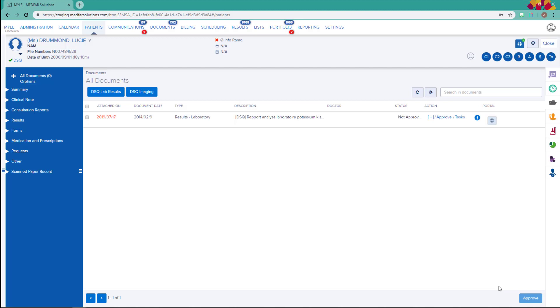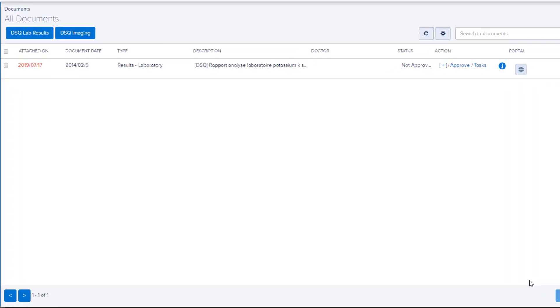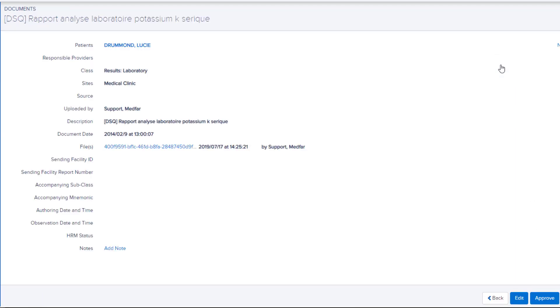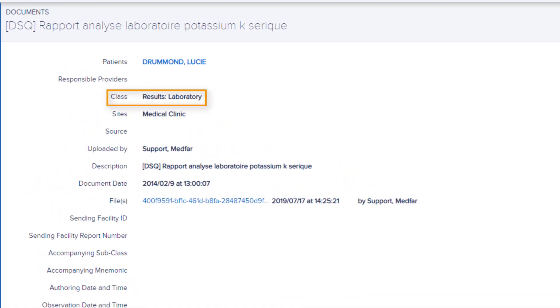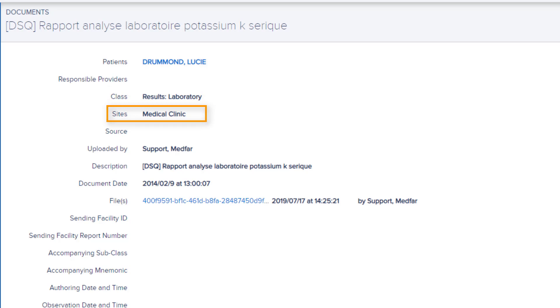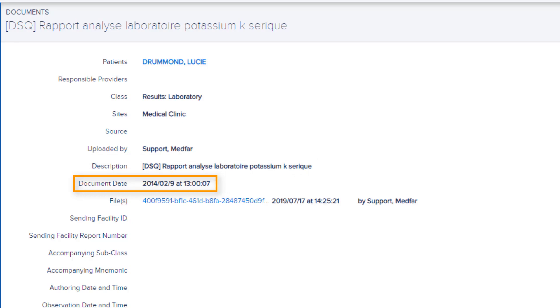Notice that the imported document now appears in the list. Click on the little eye to view its details. Many of the document's information are filled in upon the import. The class depends on the type of document. The site is the selected active site for the user that completed the import. The description is the same as what is displayed at the DSQ preceded by DSQ. Note that the document's date is added automatically and differs from the import date.